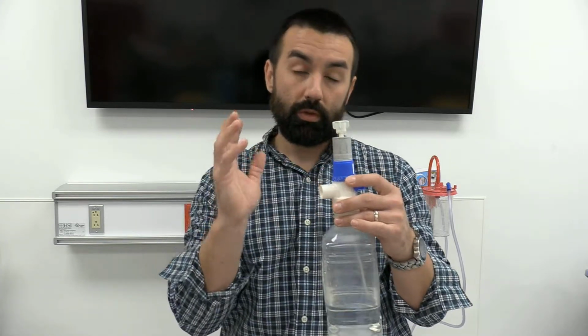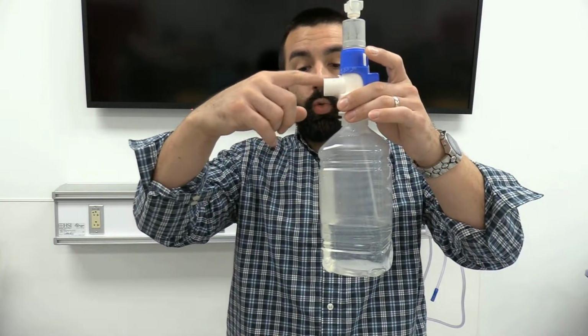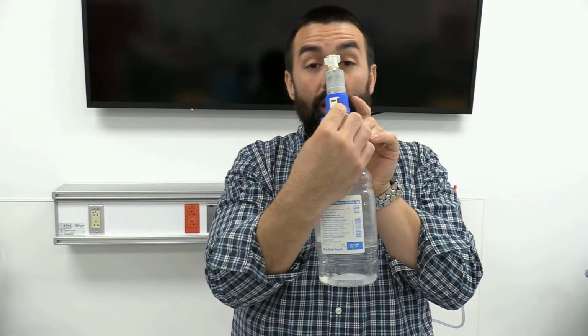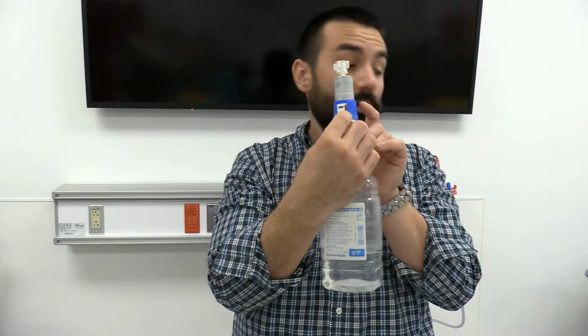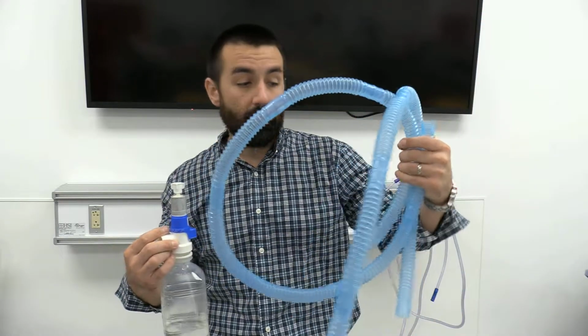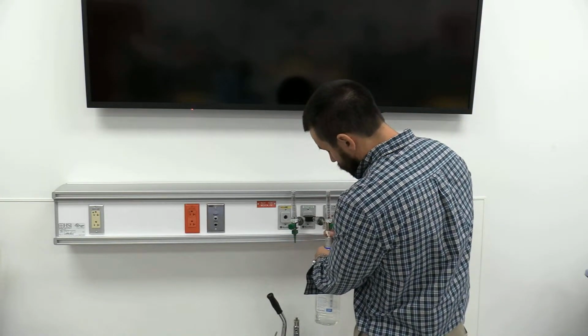So some of the standard connection sizes in respirators I've kind of alluded to in lab, we utilize a lot of things that are either 22 millimeter or 15 millimeter, okay? This particular piece has got a 22 millimeter outer diameter attachment or outlet, okay, that allows us to put something called corrugated tubing on there, or large bore tubing, okay? And we use this stuff a lot in respiratory care. So I'm gonna go ahead and put this on.